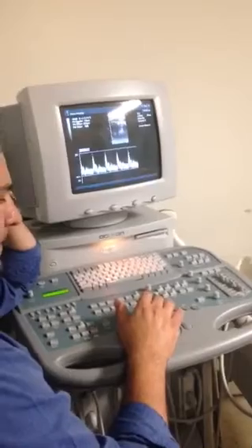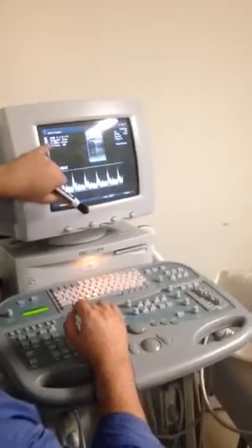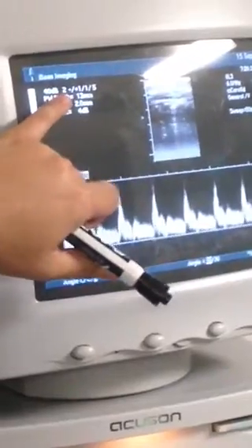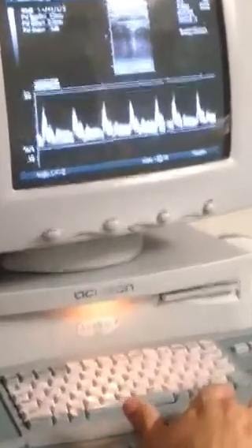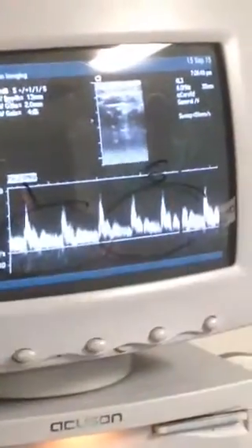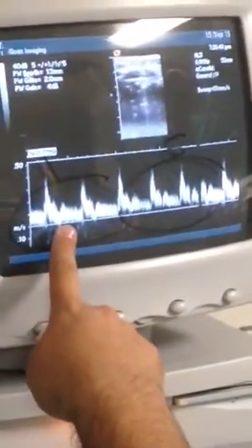All right. Now, there's filter. Look what's going to happen, guys. What's the filter here? The filter here is 2. Change the filter. Yeah, 3. Okay. Look, up to 5. Let me drop it down to 1. This is 1. I'm going to go back right away to 5. What's the difference? Look at this one here. That's a 1. The filter here is 1. And here, I increased it up to 5. What do you see as the difference? Here, we have some noise because I didn't filter that much.